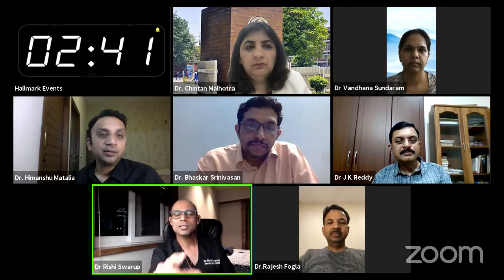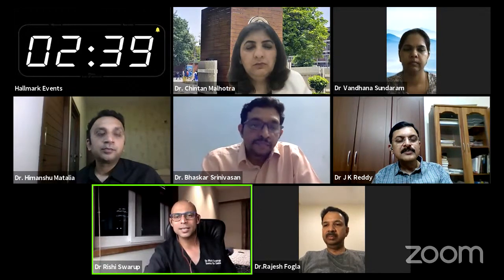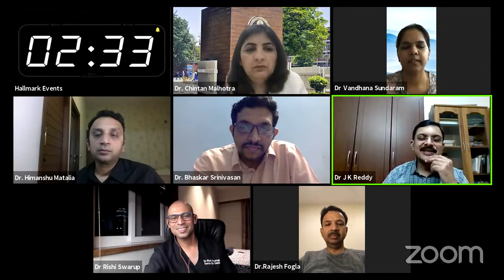Dr. Vandana, was this flap well centered, or was it slightly decentered? Yeah, perfect, luckily. It's well centered, and there is no hinge ablation. The entire thing we measured, the entire thing decentered by x by -1 and y by -1.5. I still think that there is a software bug somewhere. The auto centering wrongly went ahead, but the data shows very good fixation. Everything is fine with the report.